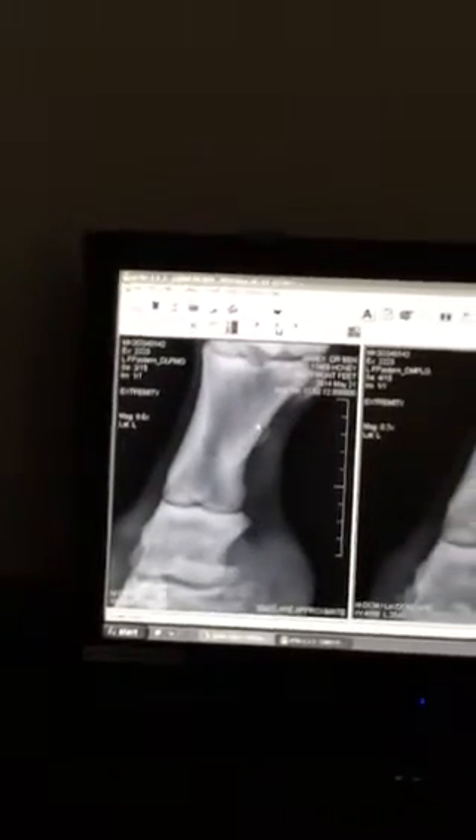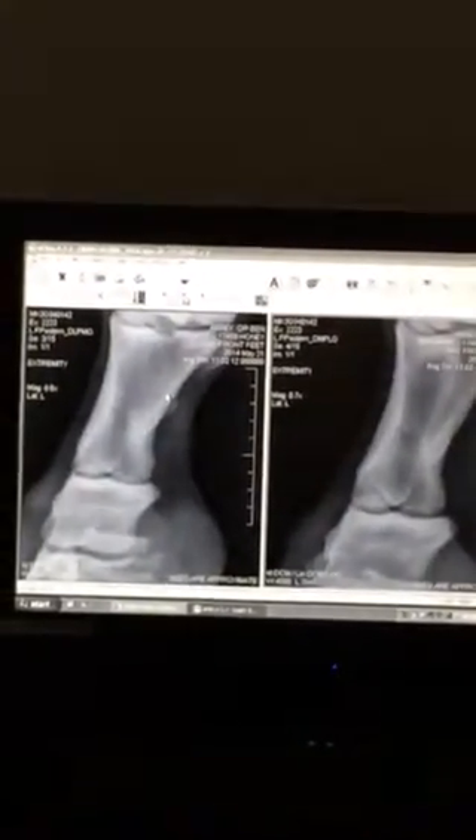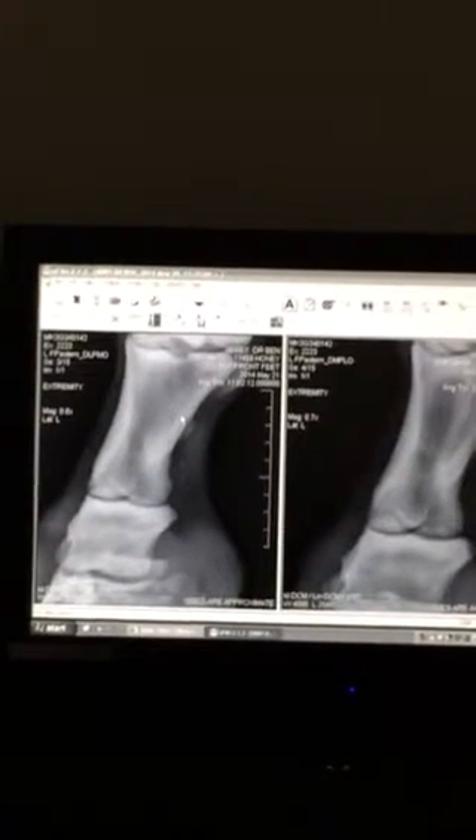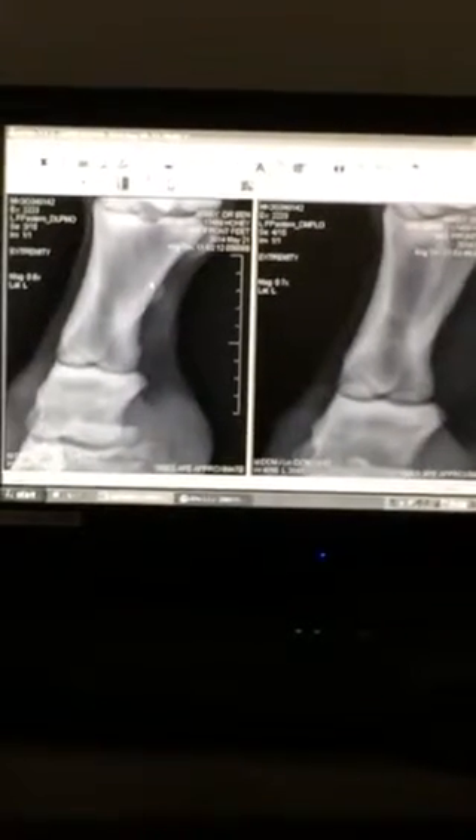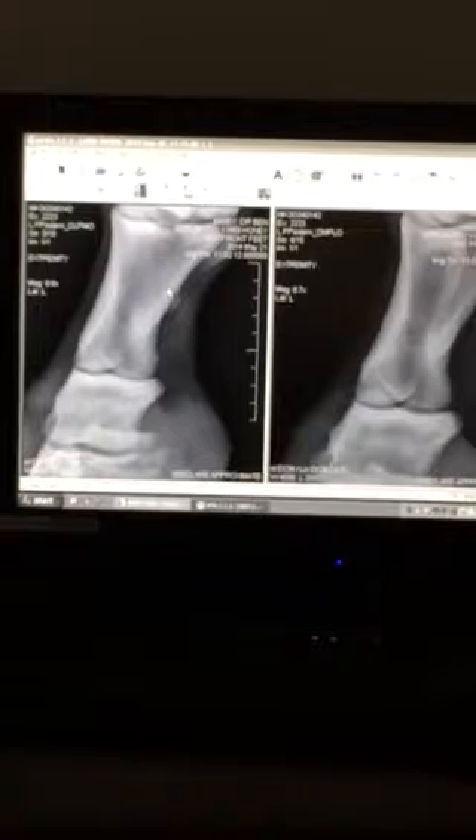I usually put 60 or 80 at least in the Pasterns. The way I learned to do them in school is different than what I've learned from Snyder. I'll hold the foot this way and come from plantar, lateral or medial depending — I'm a lefty, so on the right front I'll come from lateral, quite plantar. If the tendons are here, you're just coming right alongside the tendons and dropping the back of the joint. When you're cupping it, you can actually feel that joint distend even with just a couple mils of Depo — really nice. I was blown away the first time I felt that; you'll feel it under your fingertips on the dorsal side of the joint. So I put 60 or 80 of Depo in each Pastern, and I would put 6 to 9 of Betamethasone, or 9 or 10 of Triamcinolone, and HA in the coffin joint.